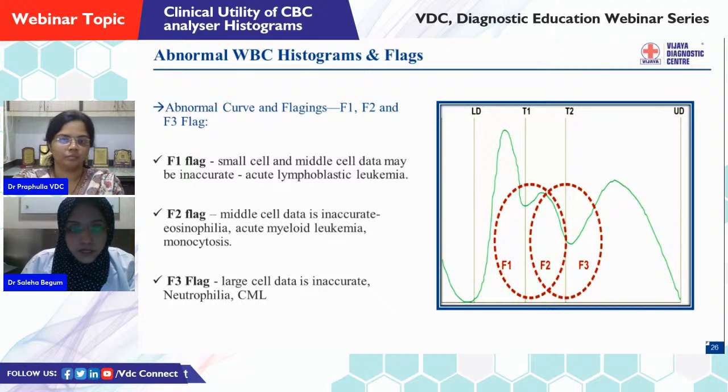We get an F1 flag. F2 flag: mid cell data is inaccurate, meaning eosinophilia could be there. There could be monocytosis. There could be acute myeloid leukemia possible. In an F3 flag, the large cell data is inaccurate, such as in cases of neutrophilia, shift to left, chronic myeloid leukemia. We get F3 flagging, meaning the machine is able to count, but you cannot say accurately which population it exactly is.